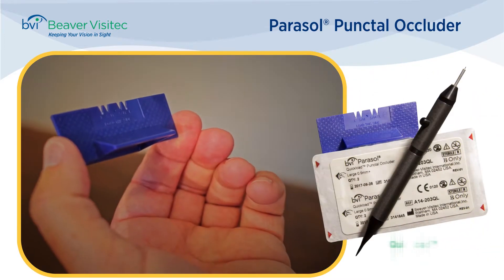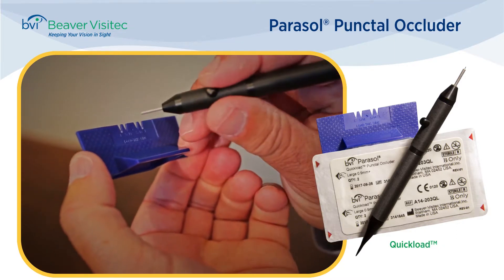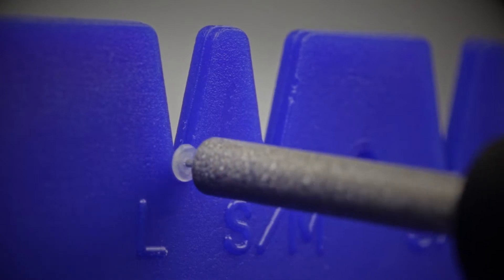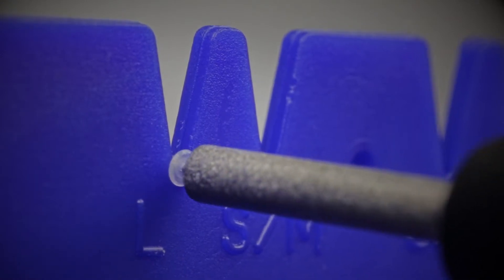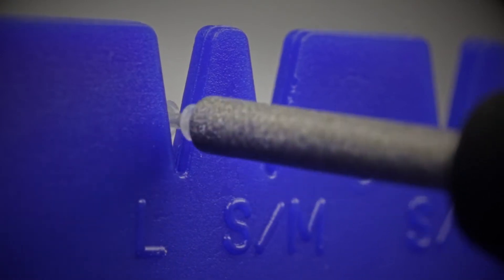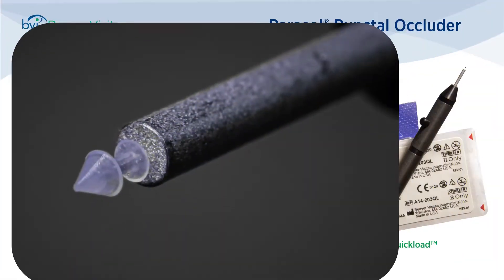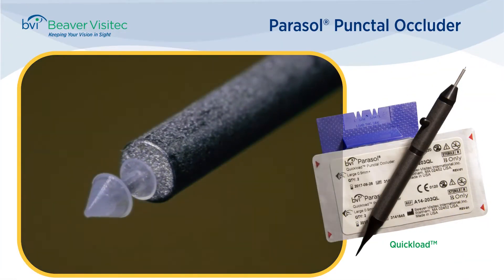The quick-load provides sterile plugs in an economical bulk format. To load, carefully guide the pin of the inserter straight into the hole of the dome. Slide the inserter upward, lifting the plug away from its stand. Then, to ensure that the pin is fully in place, gently push the plug into the cone-shaped dimple located in the center of the stand. And now the plug is ready for insertion.